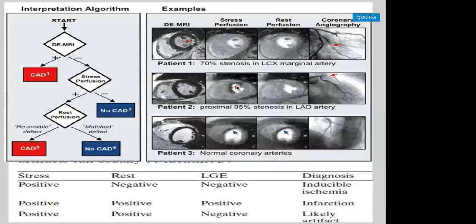So these are the typical examples which we can see here in different patients. How does it look? These images are very, very important as well. I would really like you all to go through these special images if you really want to do something in cardiac imaging. Then coming to myocardial tagging. Strain can be defined as a local fractional change in the length of myocardium as it shortens, okay? Negative strain is when it shortens, otherwise if it lengthens, it is called positive strain. The quantitative measurement of the strain pattern requires determination of precise tag position by using different algorithms. So can anyone recall how myocardial tagging looks?